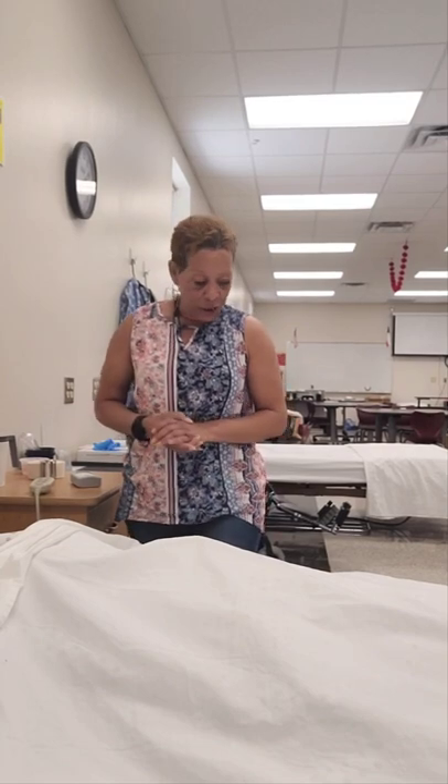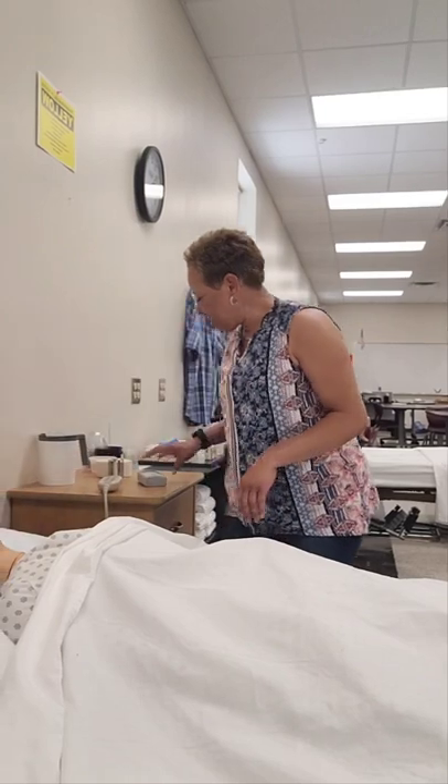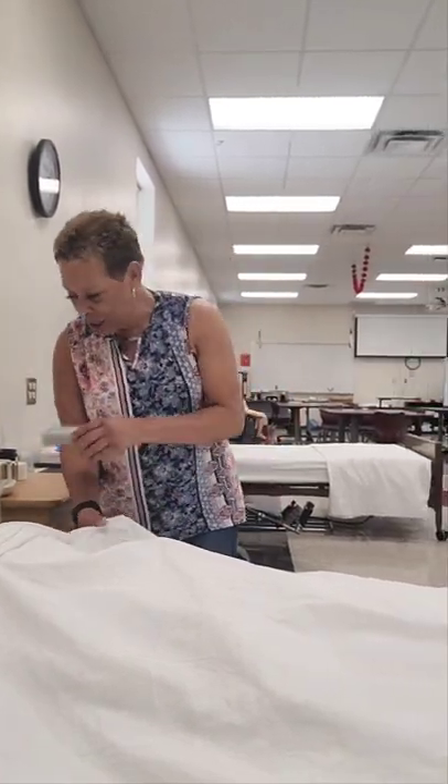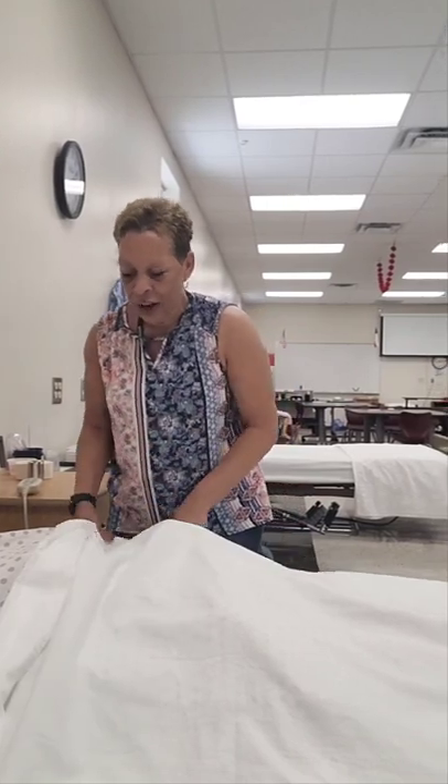Hey, good morning Mrs. Jones, how are you? Awesome. I'm Julie, I'm your CNA, and today I'm going to be cleaning your catheter. Before I get started, I want to make sure your bed is in a low, safe position — and it is. Your bed wheels are locked, your head of bed is flat. I'm going to give you your call light and provide you with privacy by closing your privacy curtain.